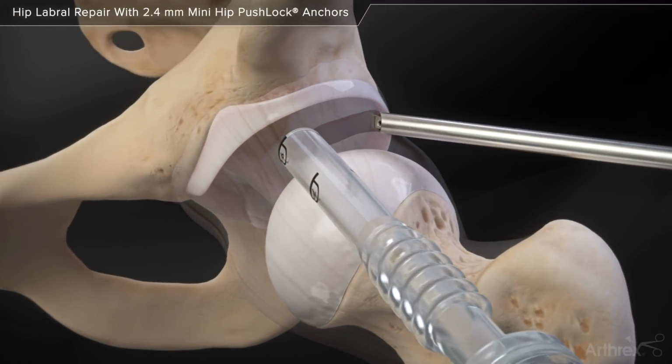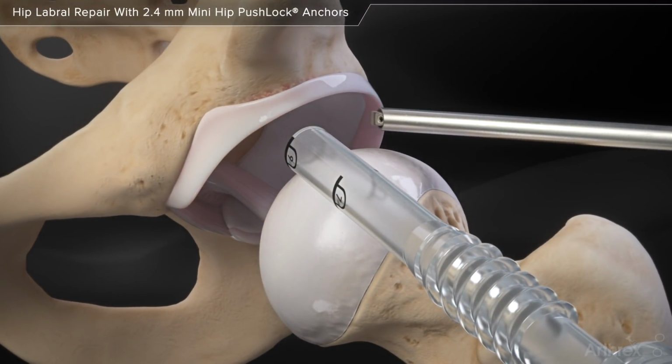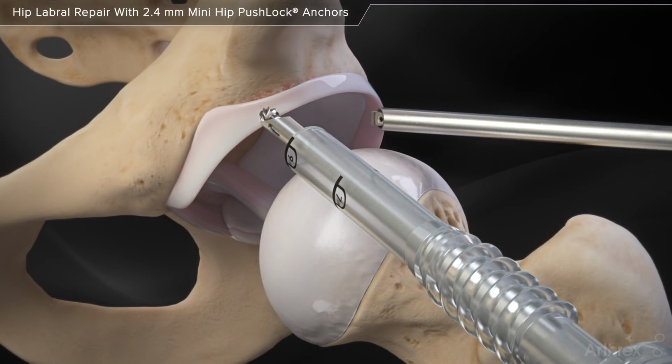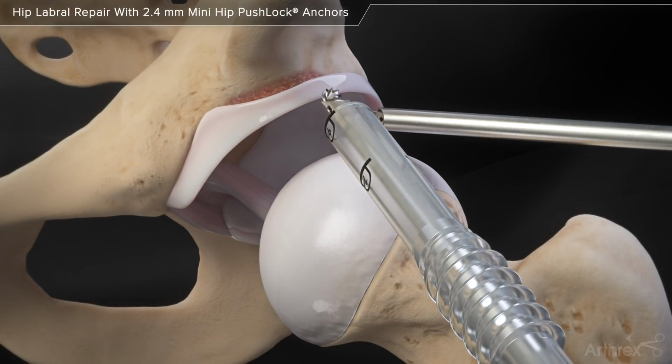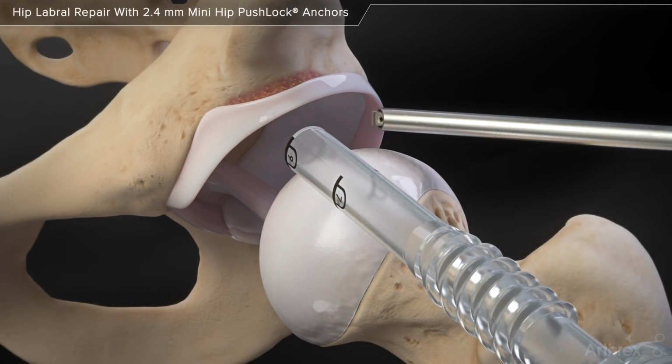A retractable hood burr is used to complete an acetabuloplasty and prepare the rim for anchor placement. The sheath of the burr can be exposed to protect the capsular and labral tissue or retracted to give better visibility.